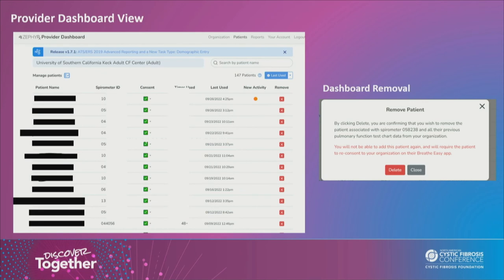I actually go in daily and I look, because a lot of times we have prompted people either after a visit or after initiation of a triage, or after starting oral antibiotics or initiation of inhaled antibiotics, or we sent them home on home IVs. We wanted to check quickly, be able to analyze, and then be able to pivot in our treatment regimen if required.